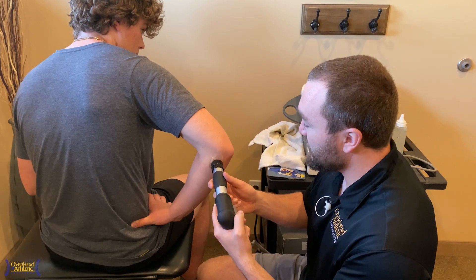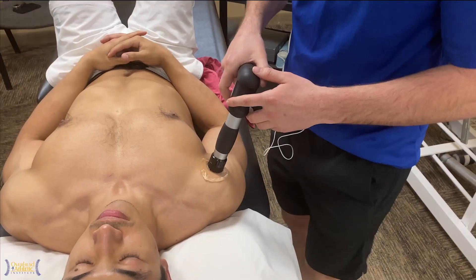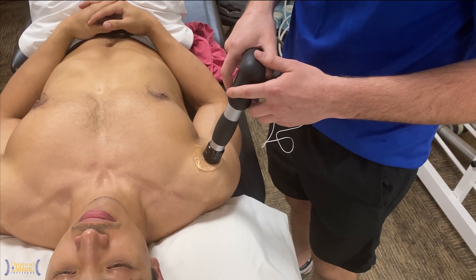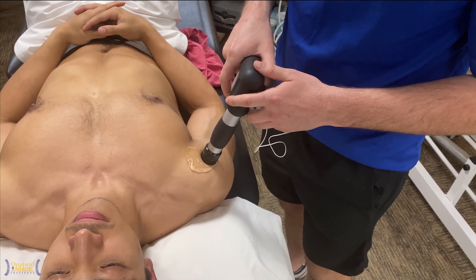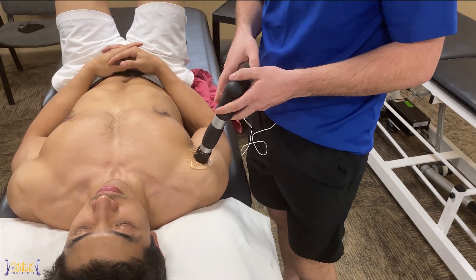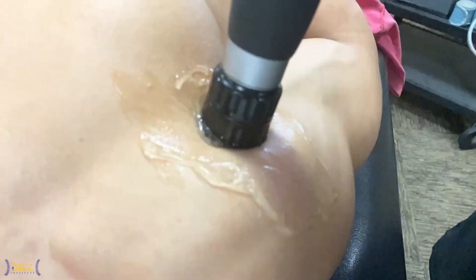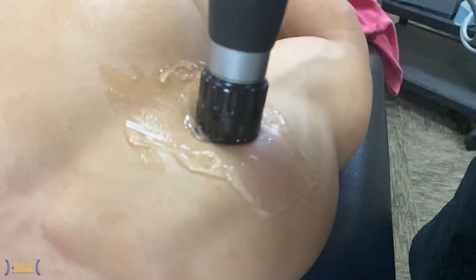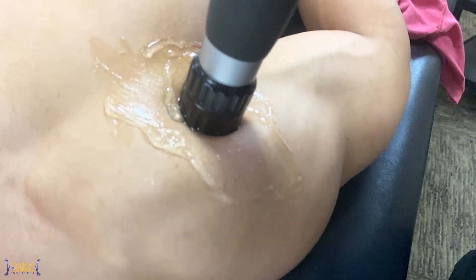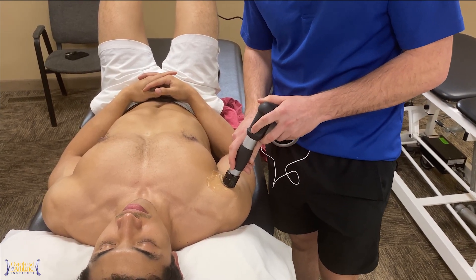If you missed our video on the UCL — shockwave was initially developed to break up kidney stones. We use it now for calcific tendinosis, and we use it in our throwing athletes for UCL tears when we have access to a machine. I treat patients out of HealthQuest here in Oxford, and so one of the things we have access to here is shockwave therapy.